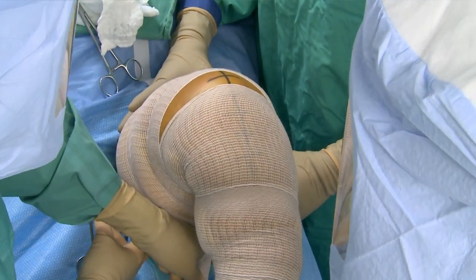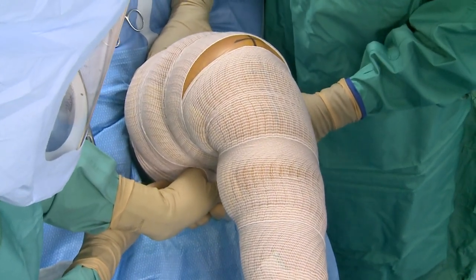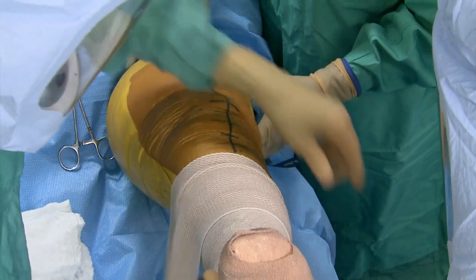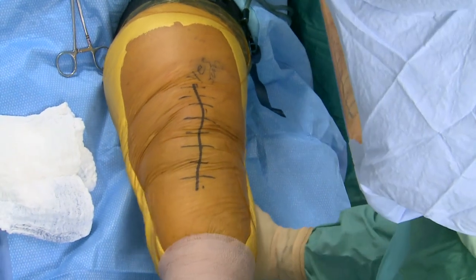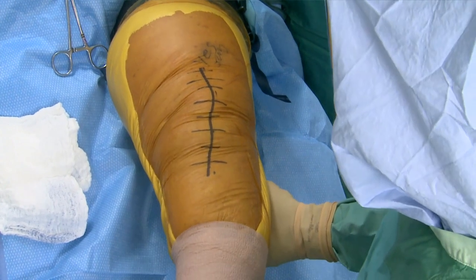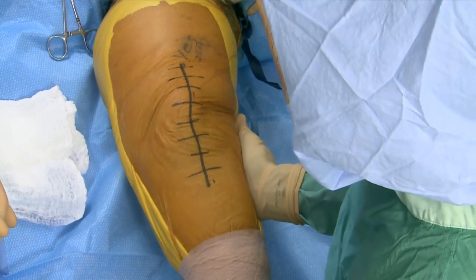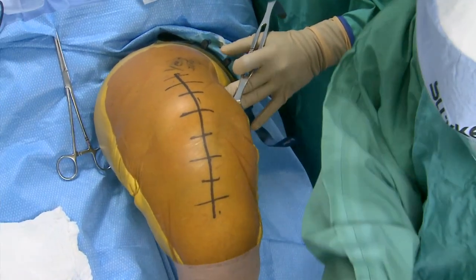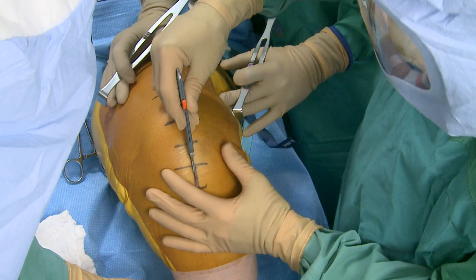We're going to go from the beginning. Dr. Morrison is a much more efficient surgeon so he's actually going to do the whole case on film. We've got a varus knee, and when I give her a varus stress she goes into about 10 to 12 degrees. She was correctable — with a little flexion we can almost get her back to neutral. I'm shooting for roughly zero degrees mechanical axis. Our incision is just a midline incision.